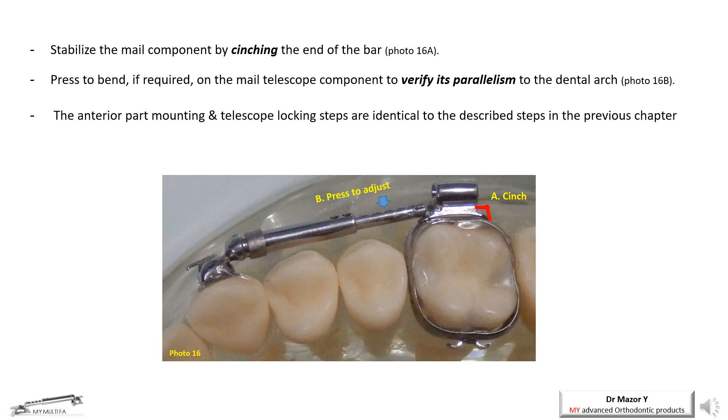At this point, the posterior part of the telescope needs to be stabilized by cinching the distal end of the wire extension (figure 16a). Next, the male telescope part needs to be parallel to the buccal teeth line, horizontally and vertically, which can be easily achieved by finger pressing or by any orthodontic pliers (figure 16b). The next step — the anterior part — is mounted identically to the previously described steps.